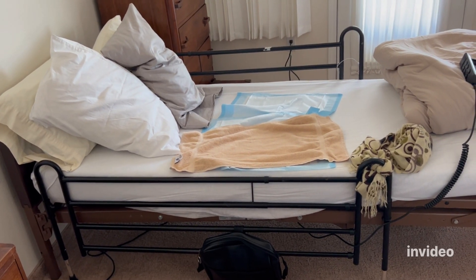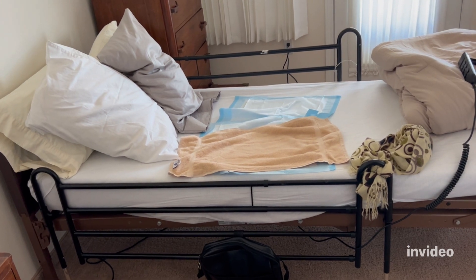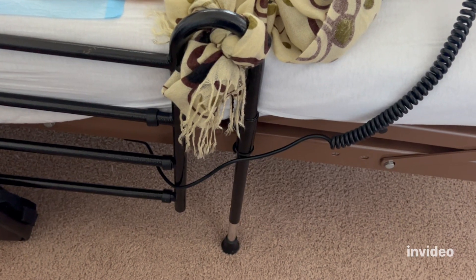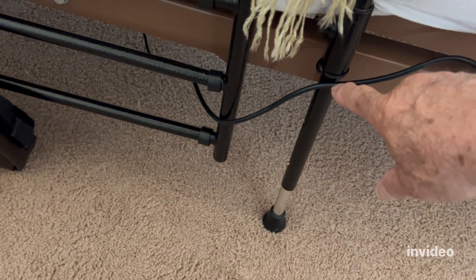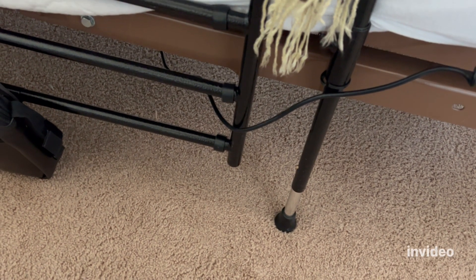This hospital bed has rails that are operated from the outside only, not the inside. I disconnected these latches right here, so the rail is no longer attached to the frame.